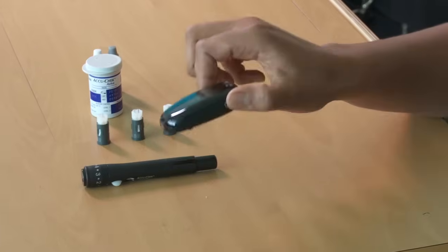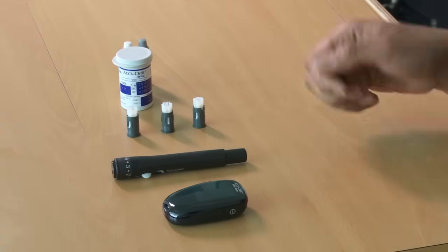Now I'm going to show you how to perform a blood glucose test. There are lots of different meters on the market and they mostly follow the same principle, but for the purpose of today I'm going to demonstrate using a nanometer and a fast clicks finger pricker.